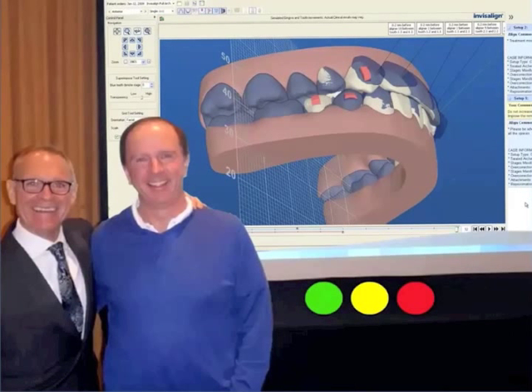I think that all of our doctors listening now have a better comprehension of the level of intricacy that you have built into the templates. And the point value and the differentials between the point value of an assessment at the initial treatment and the point value at the conclusion helps us determine what is the best or the most appropriate treatment choice. The good news for the doctors listening is you don't have to concern yourself so much with the points. That's built into the templates.